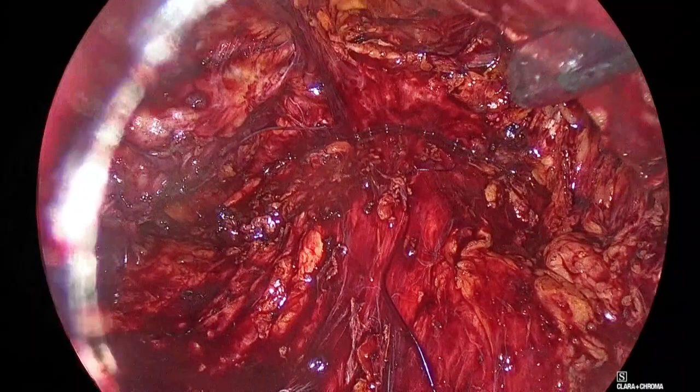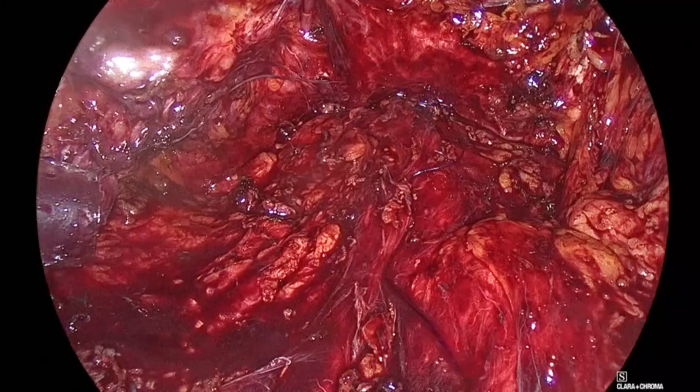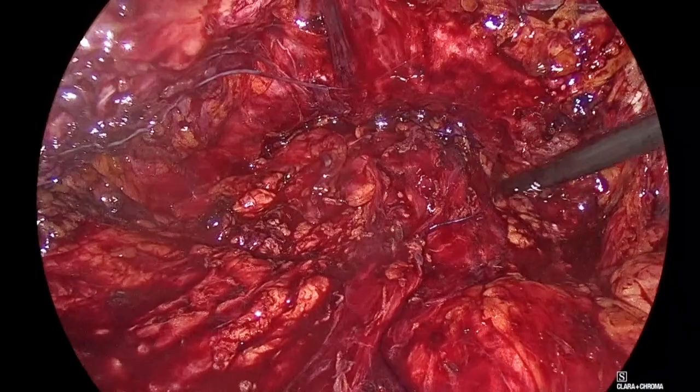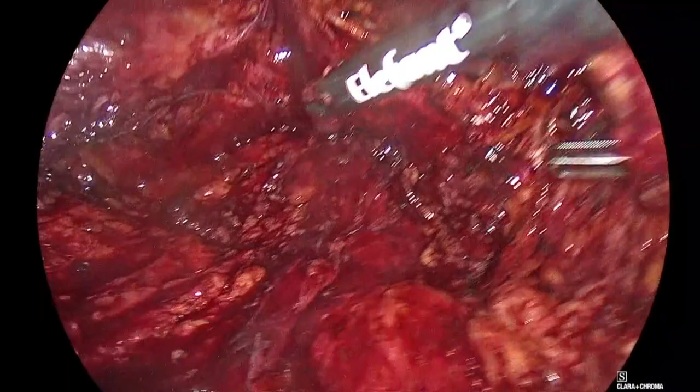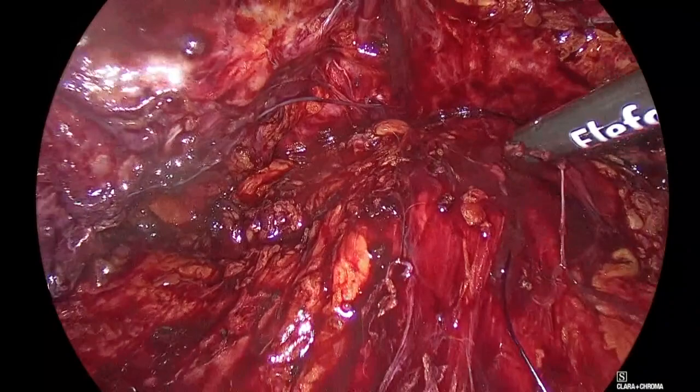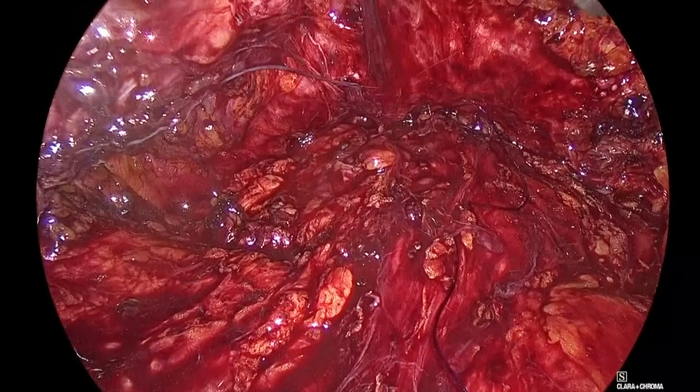It's very important at the end of the procedure to actually wash the bladder out. The bladder is bloody, it has bloody urine inside. Give me another one. So you don't want to have clots. I don't want it to be hot, please. Give me cold. So as you see, I have some tension on the bladder neck here. It doesn't bleed anymore. Be careful of your trocars. Good. It's important to wash out the bladder from the clots. One more. Good. And if we could have some Lasix also, half a Lasix or furosemide.